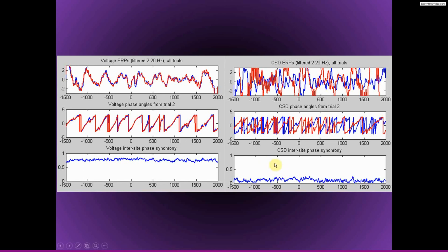So even electrodes that are very close to each other now are only very weakly correlated with each other. They show only very weak connectivity. This is an issue that we will get back to in the next section on doing connectivity analyses in EEG and the importance of the Laplacian for connectivity analyses.